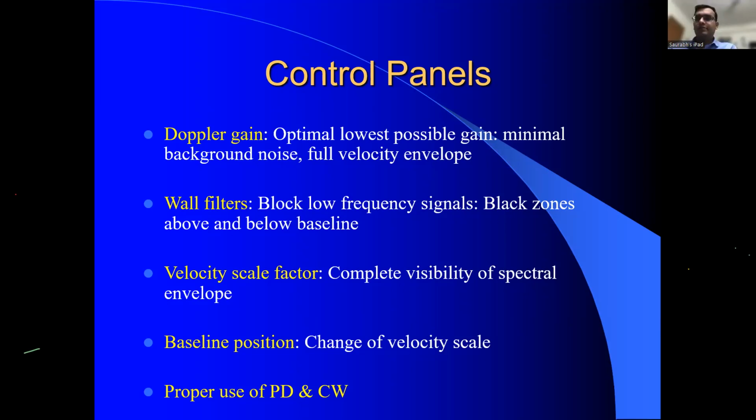May I? Saurabh, go ahead. Yes, sir. Very good evening, sir. It's an honor to interact with you. Sir, you mentioned we use pulse wave Doppler to calculate regurgitant volume and color continuous wave Doppler.